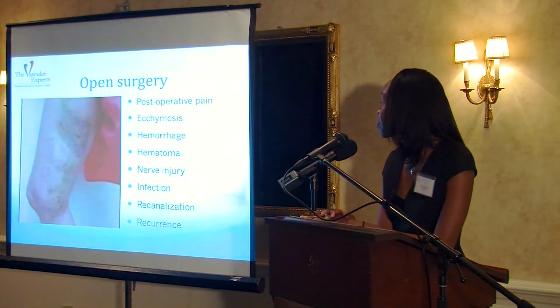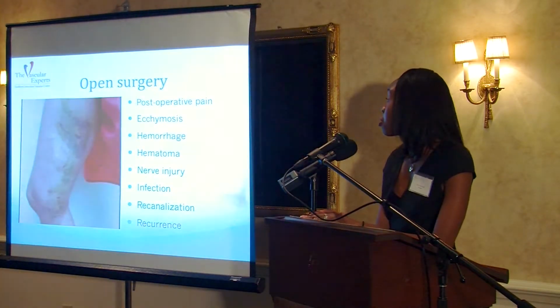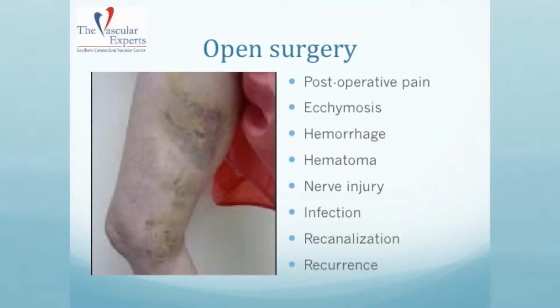Next slide. So we alluded a little bit to open surgery. Overall, we do not typically do open surgery for superficial venous insufficiency any longer. This image is a postoperative result for a patient who had a high ligation of the great saphenous vein and a stripping. You can see the unfortunate complications that come from that. It used to be certainly standard of care, but we do have some endovenous therapies that we employ now.